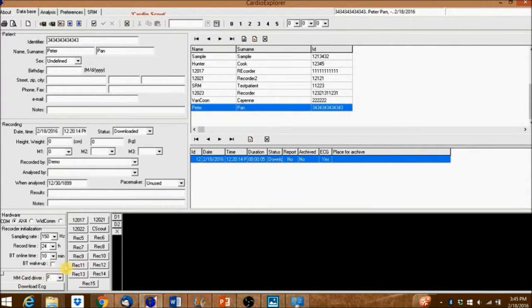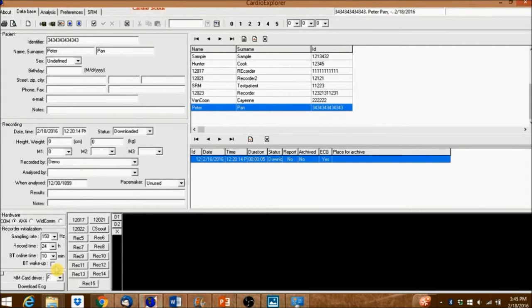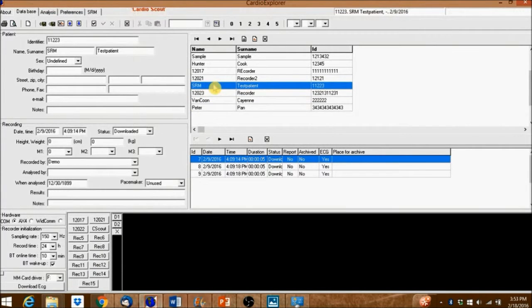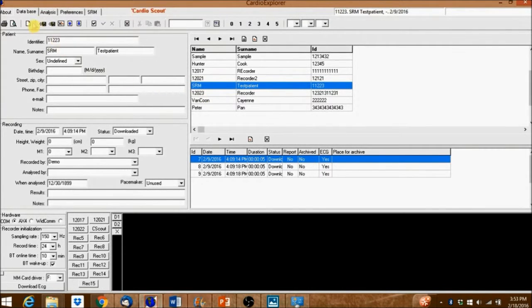and you can send the patient home. With BT Wakeup disabled, you cannot reconnect to see the live stream. However, if you want to see the stream at some point, make sure that BT Wakeup is enabled. Now select an existing patient from the database, or create a new patient, and then transfer the patient information and recording settings into the recorder by clicking this icon at the top.